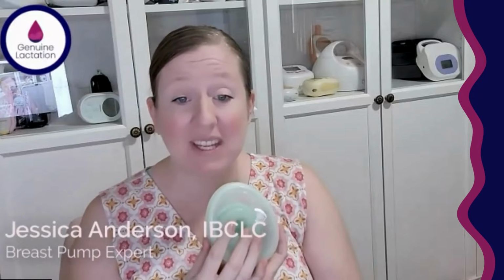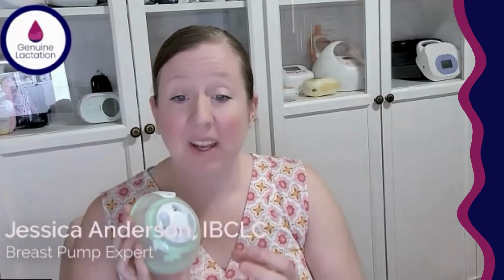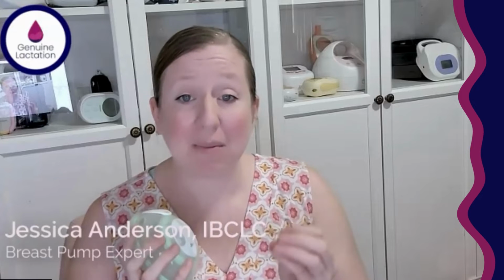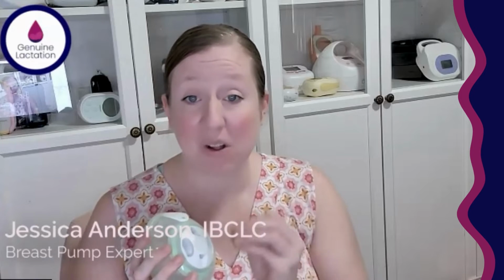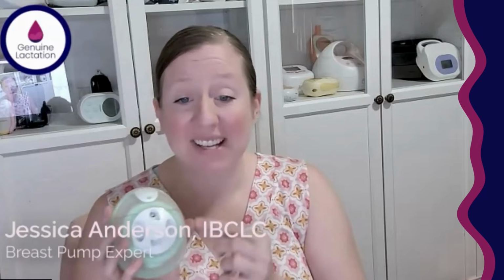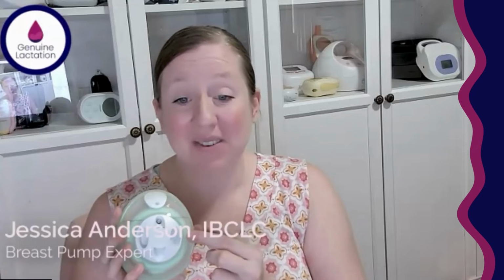My recommendation with these is to hand wash them, especially since these green silicone parts, and several pump companies use it. This green silicone likes to hold milk fat. It is a really, really sticky substance, and it likes to get in all the grooves on that silicone and really hold on tight. So you do have to have a good wash routine. Otherwise, you can actually have milk residue create that avenue for milk to get to your pump motor.